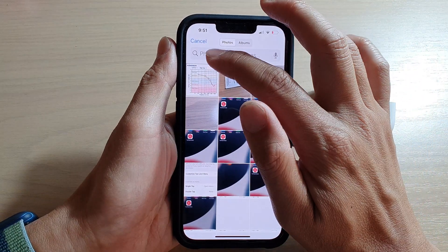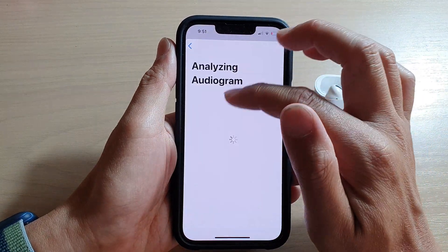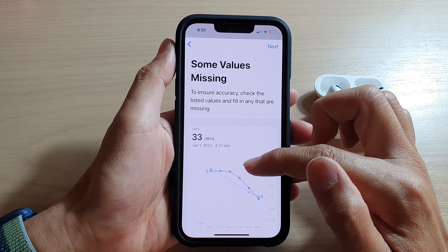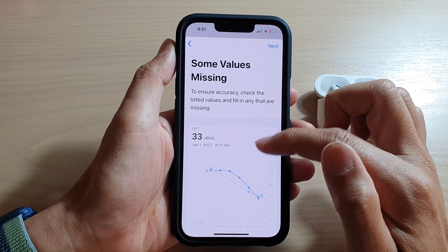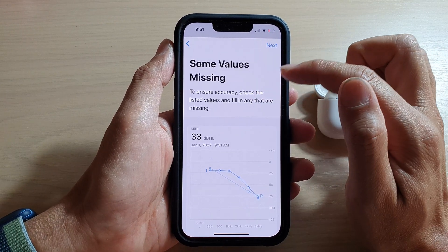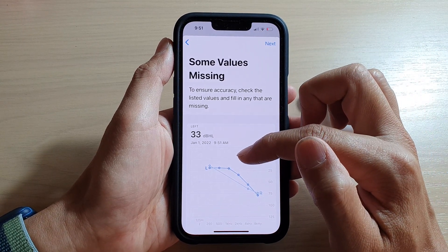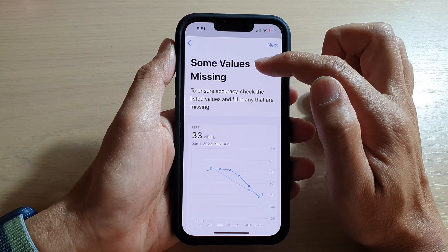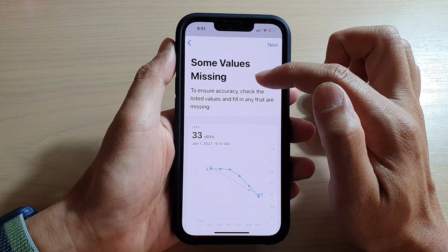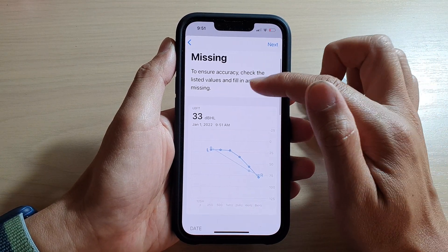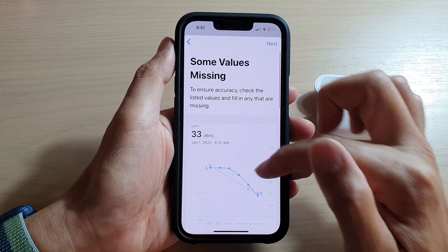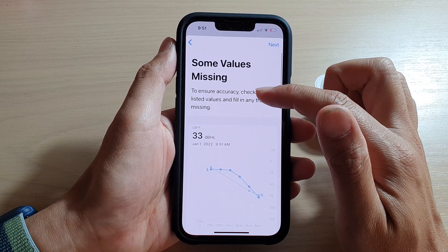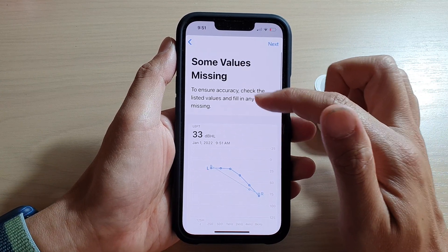Here I will select a photo that I have and it will scan the photo and import the data. Now because this is just a sample photo, some values may be missing. You can manually correct any missing values if your phone tells you that you have some missing values.